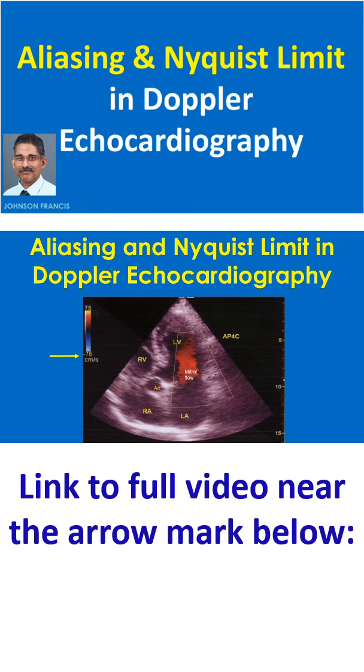In this image, the color bar is displayed on the left upper corner. Obviously, this is from a different machine.